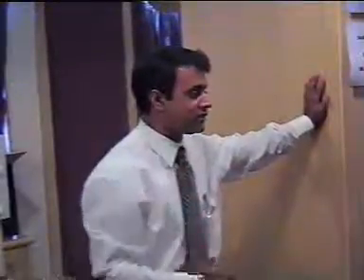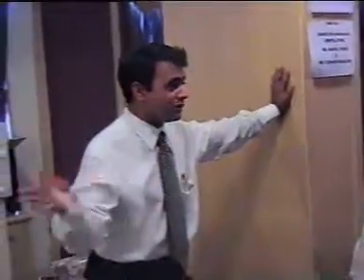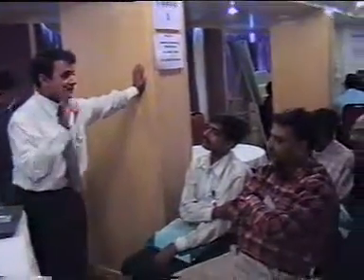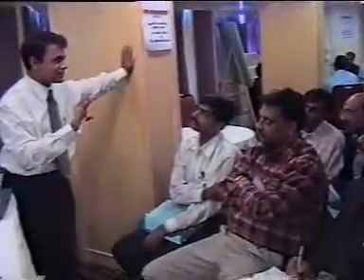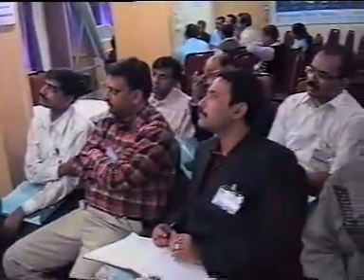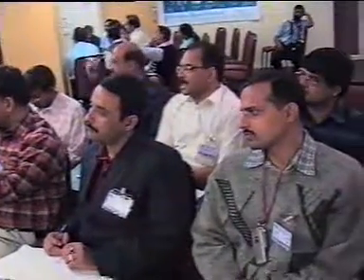You can go ahead with ventilation. But for finer diagnosis and for more important surfactant, you require an X-ray chest. Second investigation, ABG. ABG is not a luxury, it's a necessity. But if you don't have ABG, don't withhold ventilation. Go ahead and ventilate and then do the blood gas. So these 2 investigations are to be remembered. Apart from that, these are the only investigations which you can do.